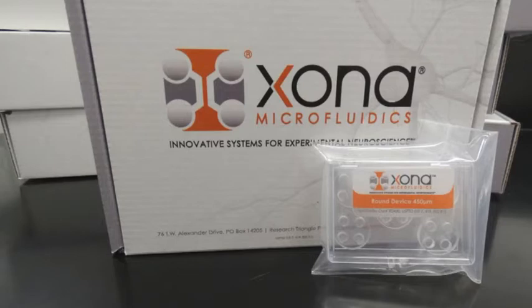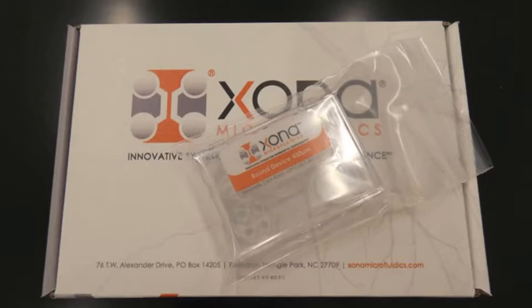An advantage of the RD series is that they can be placed into glass-bottom dishes and used for live cell imaging. Zona's RD devices have a diameter of approximately 21 mm and are compatible to use with some 35 mm glass-bottom dishes having an inner aperture of 21 mm or more.